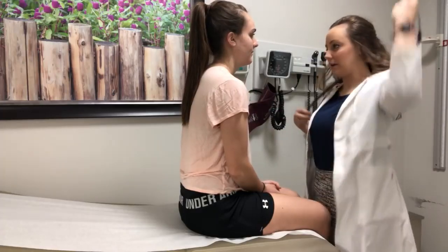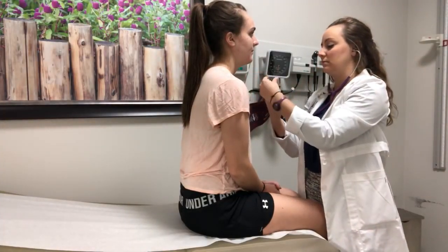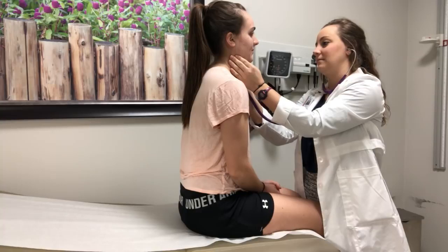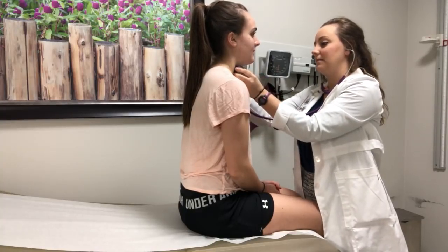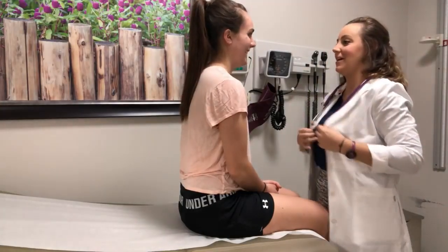So now I'm going to auscultate for any bruit. Perfect. I do not hear any bruit, palpable or auditory.